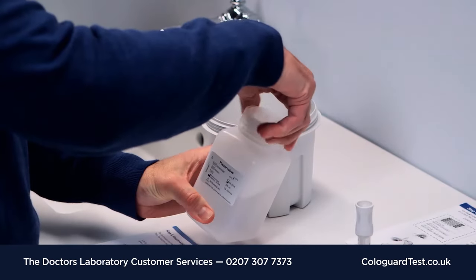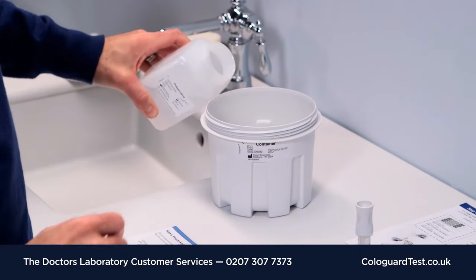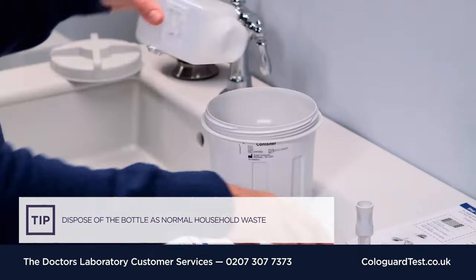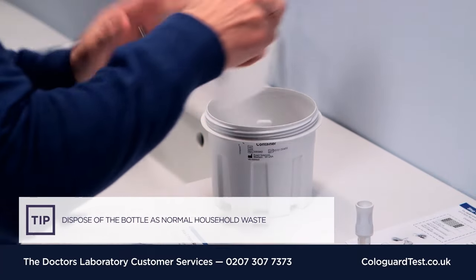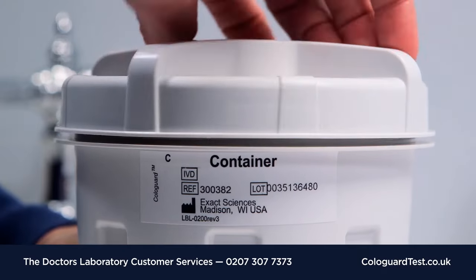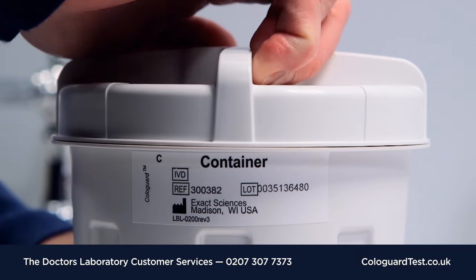Step 3. Open the bottle of stool preservative and pour the entire bottle into the container, covering the stool. Replace the lid on the container, make sure it's on straight, and screw it on tightly.